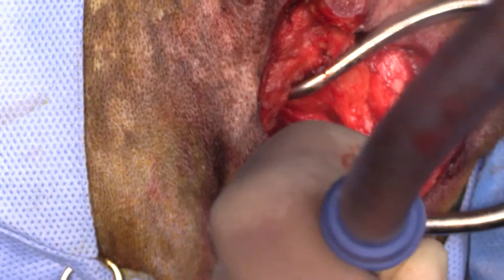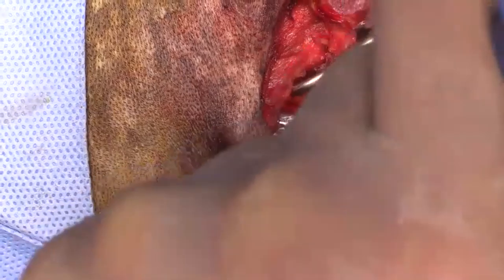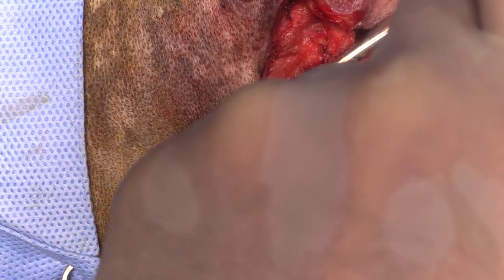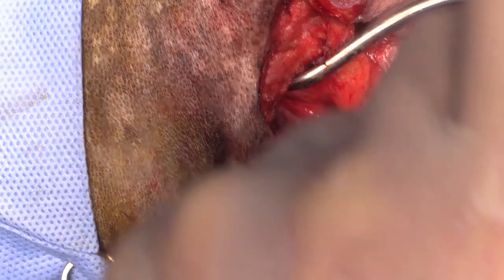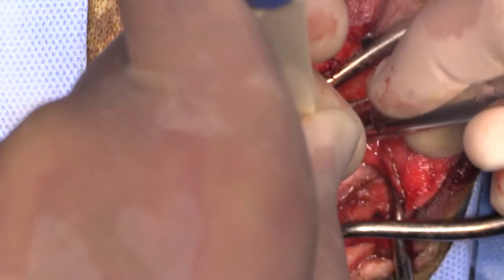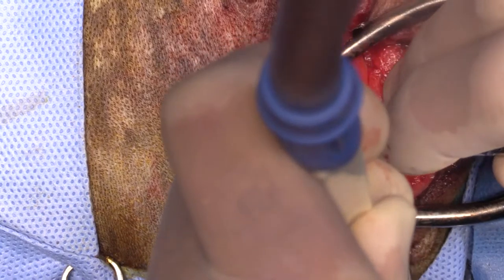This is a Staffordshire Terrier about 10 years old, I think. What I've done on some occasions is gone in with an arthroscope and introduced it into the bulla to make sure that I'm getting everything out. Sorry you guys can't see in here, but frankly, I can't see very well either.